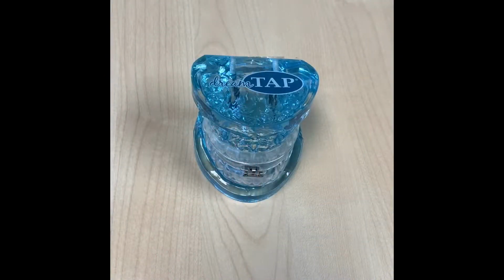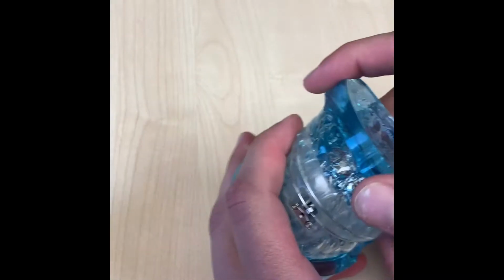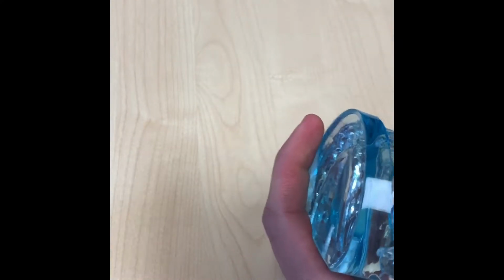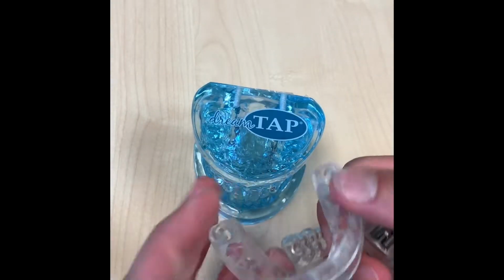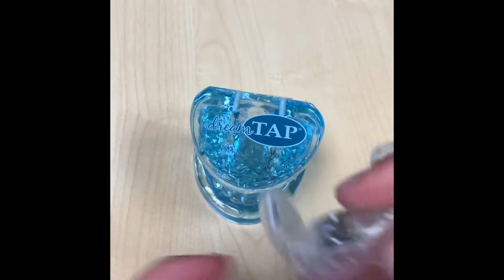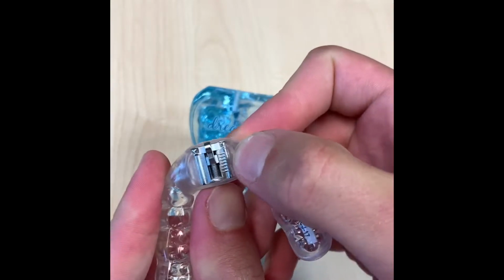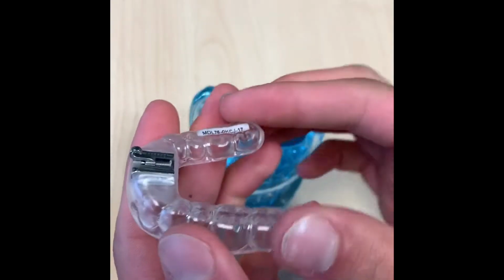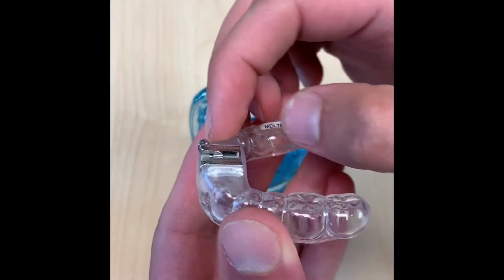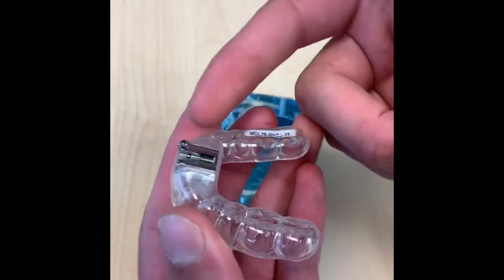With the dreamTAP, all of our advancements are going to be made by moving the hook that's located on the lower tray. See, we got the upper tray and the lower tray with the hook. Each line here will denote a millimeter of advancement. Now in order to move the lower jaw forward, it's important to pay attention and make sure that when you make the titration, the hook will move towards the back of the mouth or towards the back teeth.